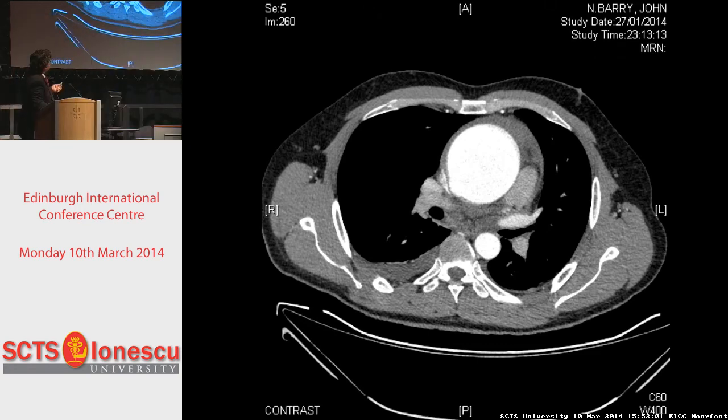And that explained the pericardial effusion because the aorta had ruptured, it had leaked, and it was only the superior vena cava which was acting as a plug. So there I am, median sternotomy, aiming for aortic arch cannulation, retracting the aorta a little bit on the right, and pop. Fortunately, I managed to put my finger in. I had a very good assistant. We managed to go on fem bypass in less than 3 minutes and apply the cross clamp.